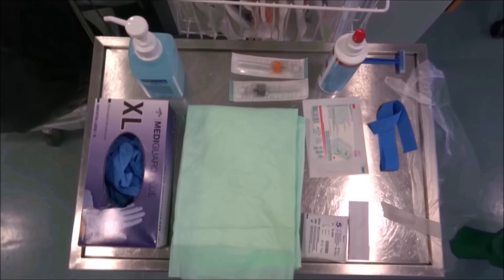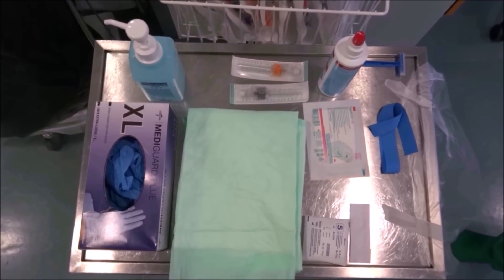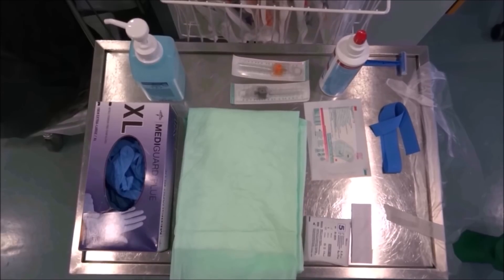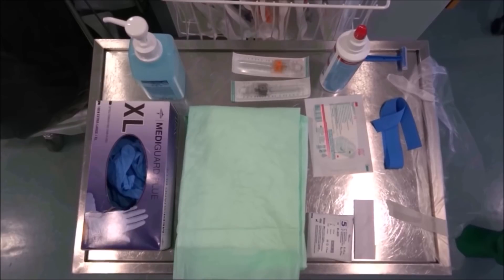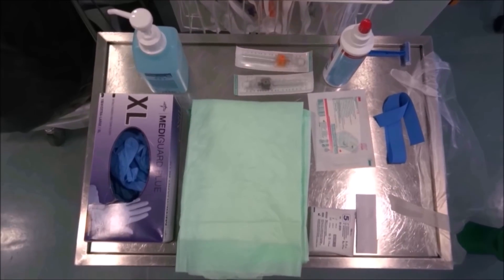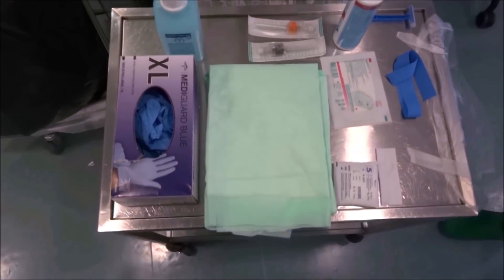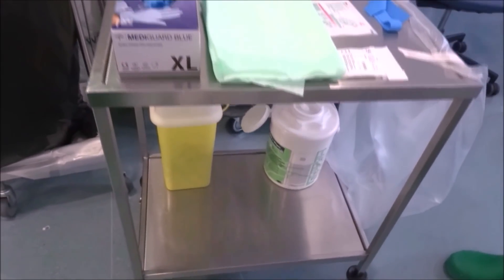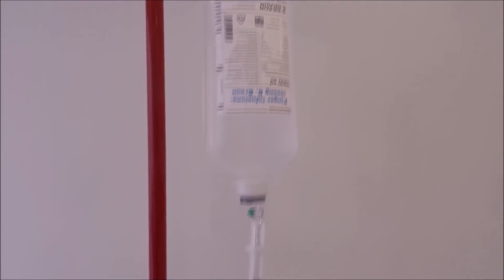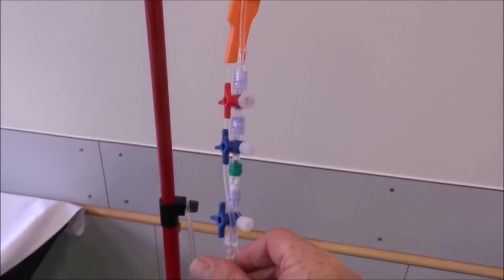Before we approach the patient, let's organize a treatment cart or tray with non-sterile gloves, a bed protector, a hand disinfectant solution, the appropriate catheters, an aseptic skin disinfectant solution, a tourniquet, sterile IV catheter dressing, an additional fixation, compresses 5x5 cm, a needle box, a garbage can or sack, and a surface disinfectant. Last but not least, let's prepare an infusion or a needle-free IV connector with one normal saline syringe.